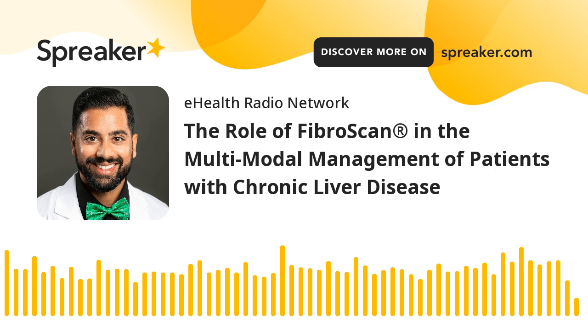So it's recommended that the provider obtain a FibroScan and then refer to a hepatologist, where further liver-based comprehensive workup can be completed. Providers will be surprised at how many patients have steatosis and fat in their liver or have fibrosis and cirrhosis that may benefit from aggressive management and referral to a specialist.